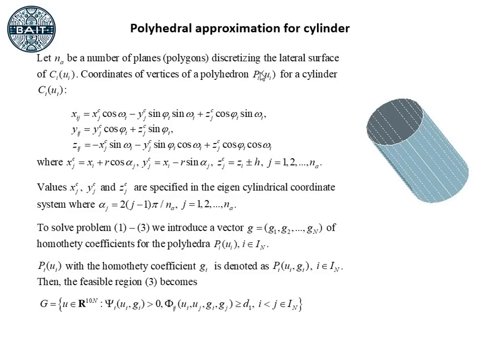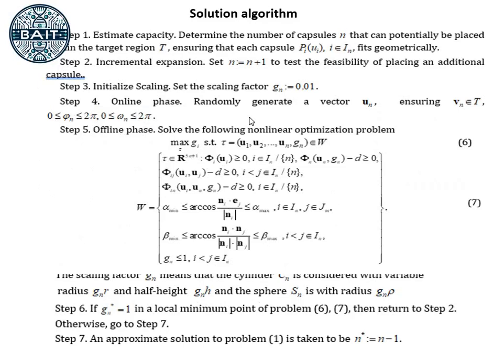To decrease the calculation complexity, a polyhedral approximation of the cylinders is applied. Cylinders are approximated by convex polyhedra to simplify geometric computations.